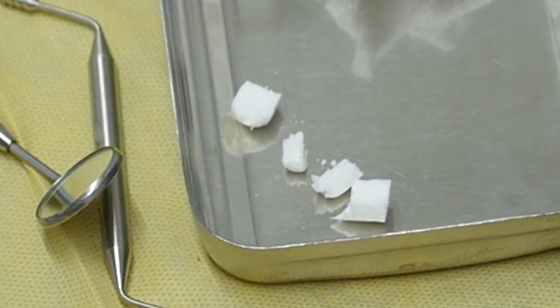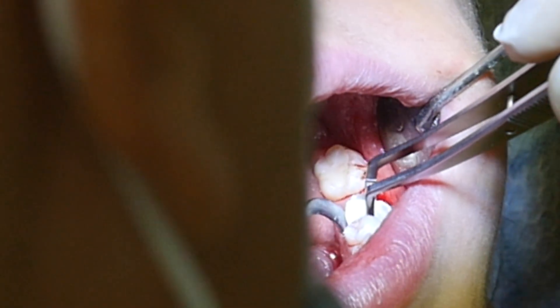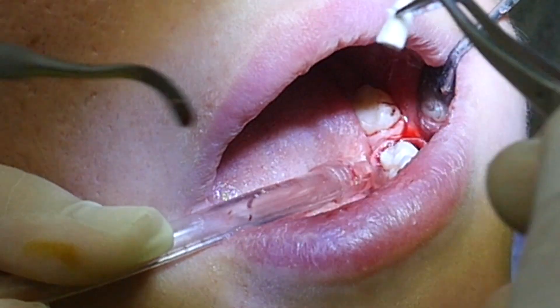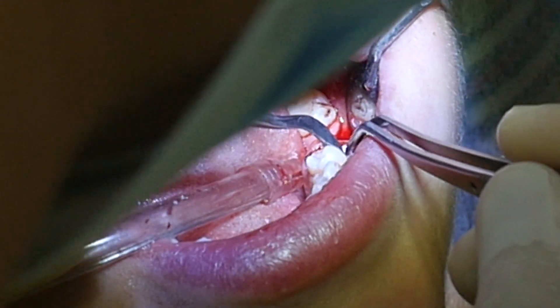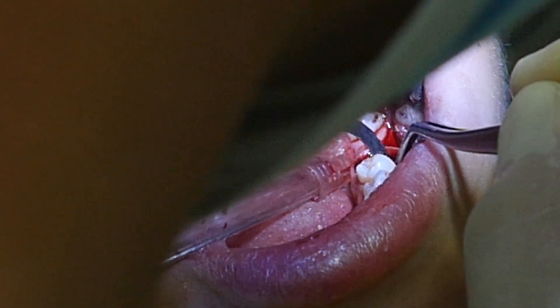When the plug is too large for the socket, it is cut into smaller parts for a snug fit. It keeps its shape and all its distinctive characteristics. DSi SpongeZenGraft serves as a protection and temporary filler of the post-extraction well during early implantation, and as a regenerative material that promotes the formation of new bone.